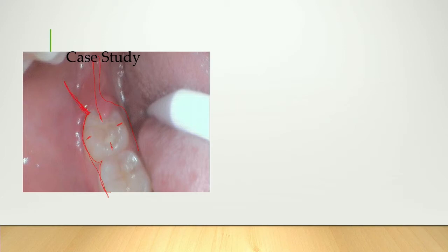This first part is down to bone. And then when you come up past this mucogingival junction here, the buccinator is in here. So don't go too deep, because the patient will have a lot of pain if you go too deep with this part of the incision. So this part of the distal incision is down to bone. This part here is in soft tissue, so just lightly. Don't cut too deep, because underneath are the muscles of the buccinator, and you cause the patient a lot of pain if you cut too deep there.